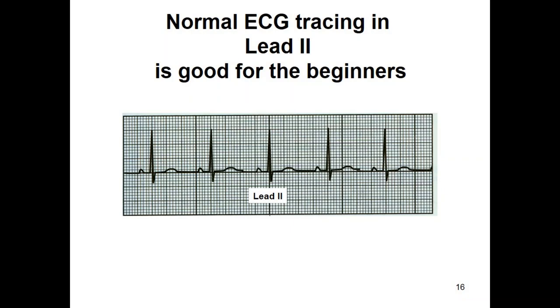This is the normal ECG recorded in lead 2. It's a good ECG, the ideal ECG, good for beginners. Ideally, you can see all the waves. This is how it looks like. We'll go on to the waves of the ECG.